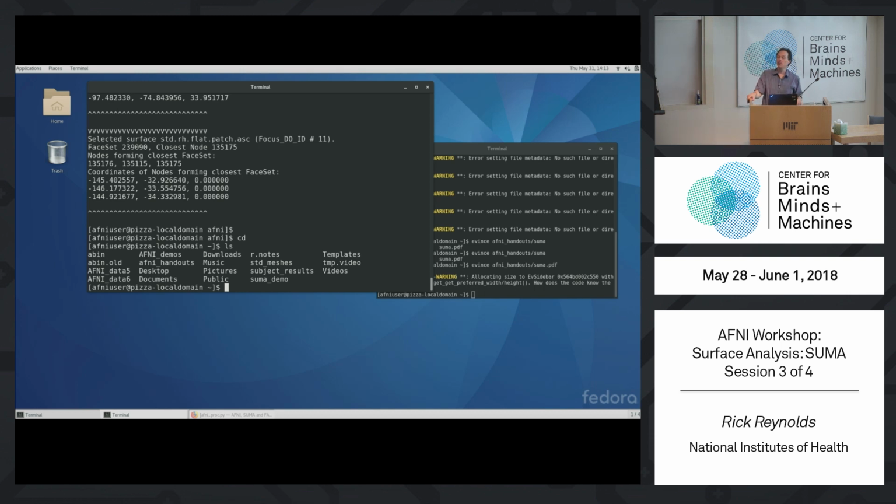So you blur along the cortex, and that also means that, assuming you've done a good job of making a surface and assuming the EPI data is well aligned with the T1 data, when you claim that this is where the surface goes, that's where the surface goes in the EPI data too. So assuming you've done a very good job with registration, anywhere you don't, all bets are off.